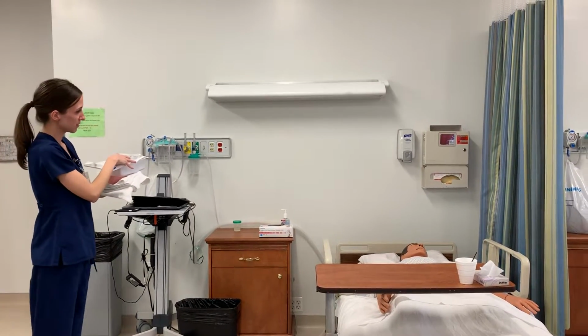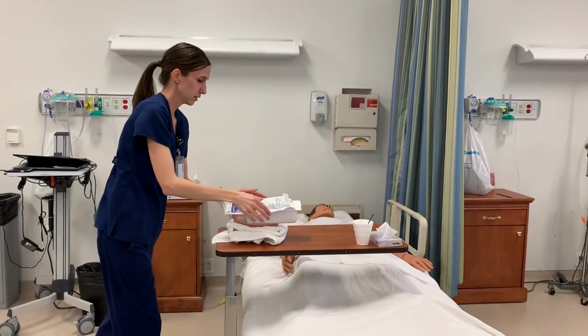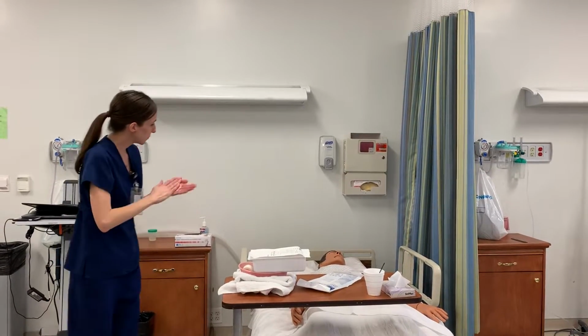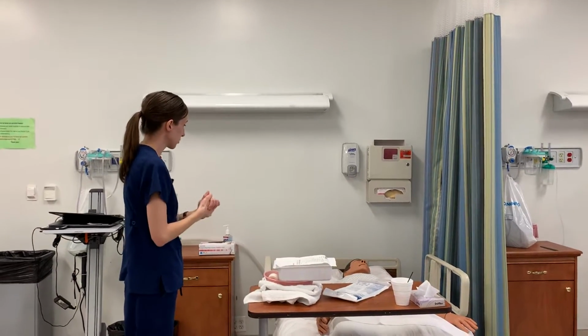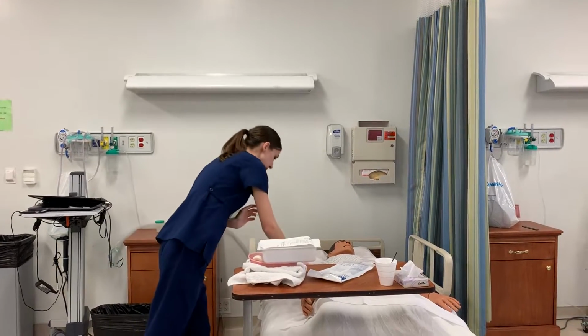Is it okay if I come in? Thank you. I'm just going to put these down really quick on a clean surface. I'm going to give us some privacy, just some hand hygiene. Hi, my name is Anna. I'm going to be your student nurse today. I'm just going to be here for about the next 15 or so minutes. Before I proceed, would it be okay if I got your name and your date of birth?